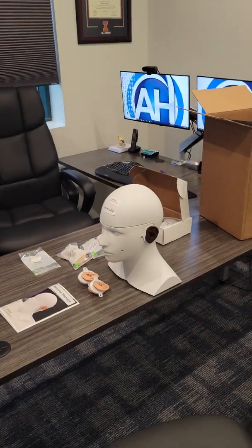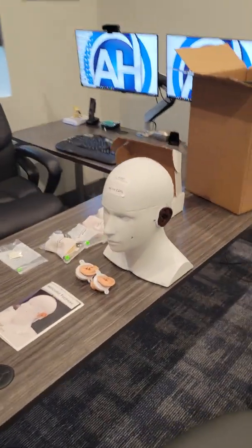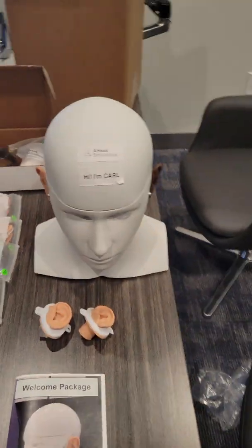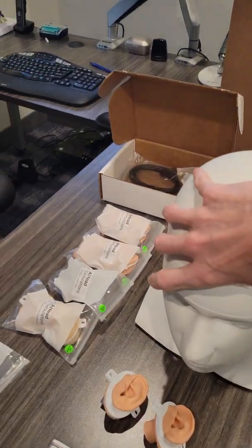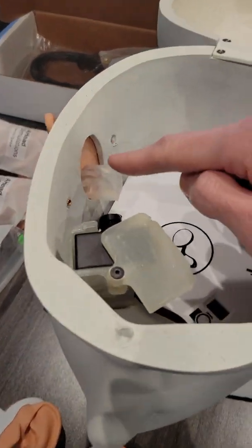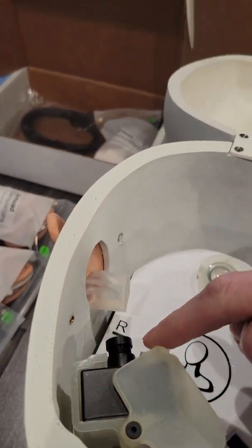Hey guys, good morning! I am super excited to introduce you to a new team member that we have — that is Carl. The team over at Ahead Simulations sent me this ear simulator, and the craziest thing about it is that it actually has transparent ear canals and it has a camera.